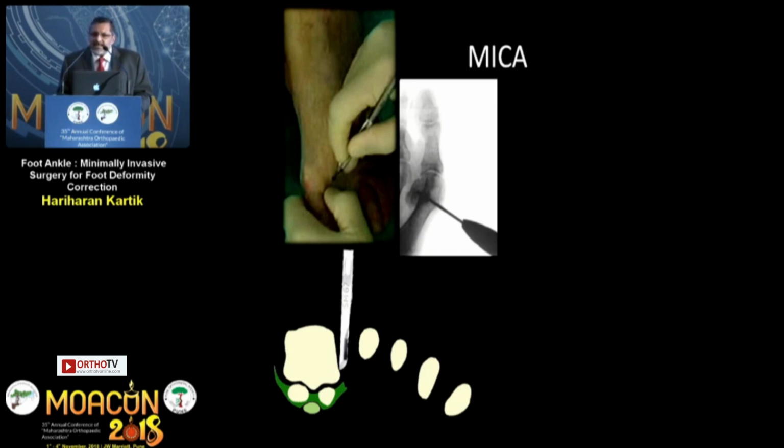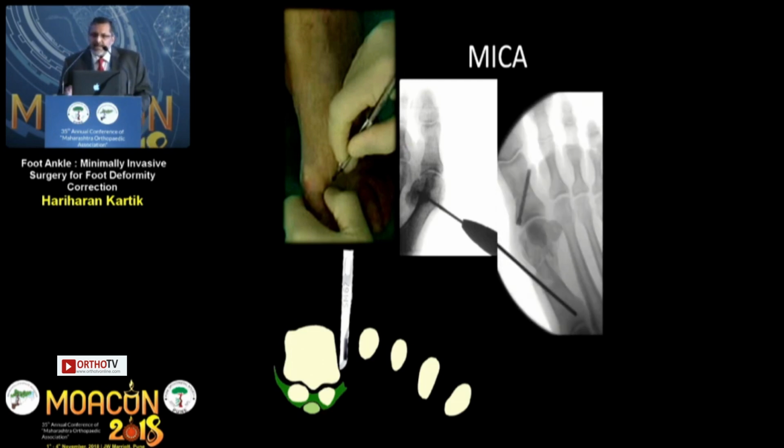There's inevitably likely to be some length loss, and that's why you angle your osteotomy so that by translating it, you don't lose your length. You climb up the hill, if you know what I mean. So the head will actually move distally so that it'll make up for the loss of limb length.